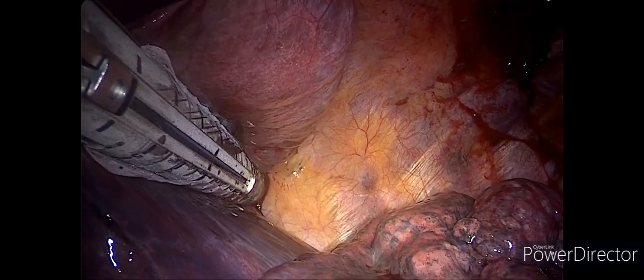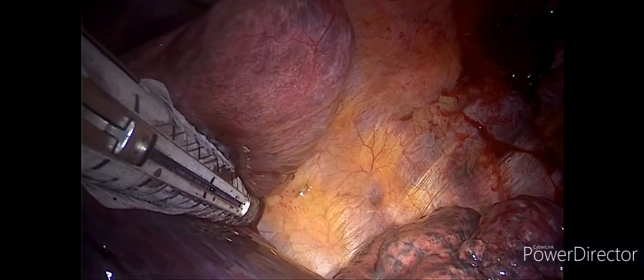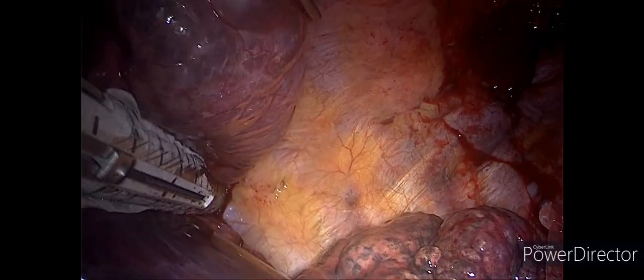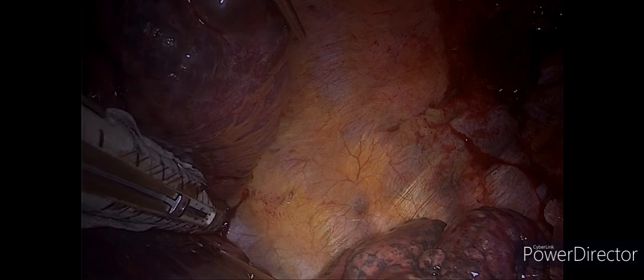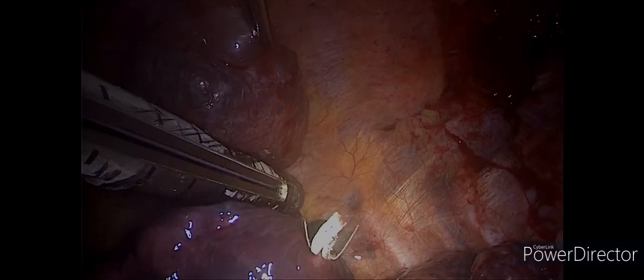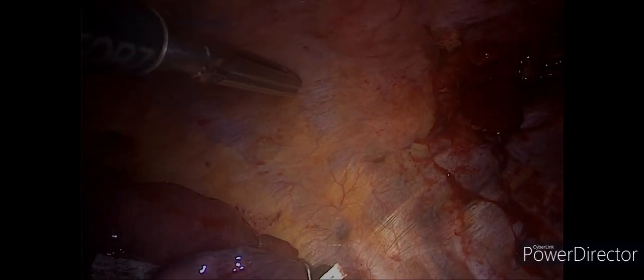You don't want to take too much tissue. If you have a reinforced stapler, you can resect the bulla at its base or in alignment with the normal healthy tissue. If you don't have a reinforced stapler, you can take a small amount of healthy tissue and not resect the bulla itself.